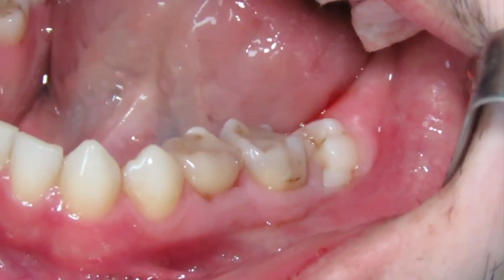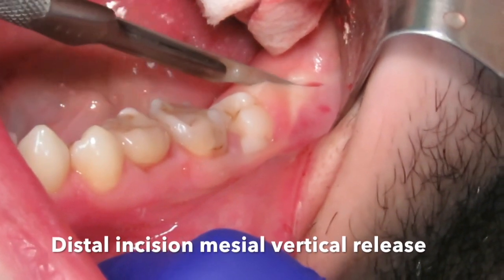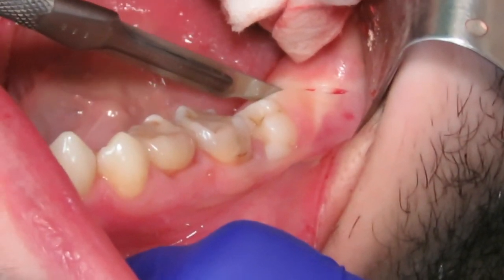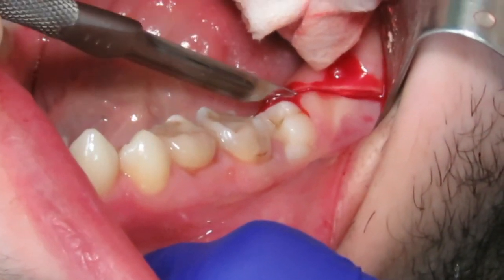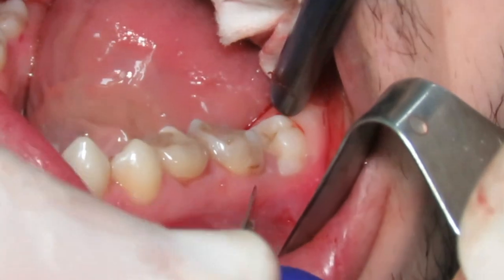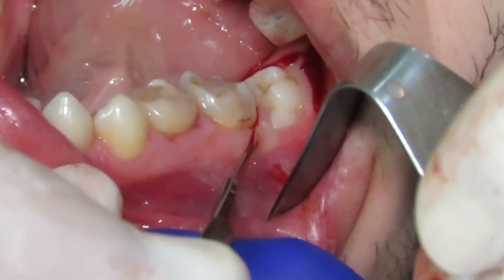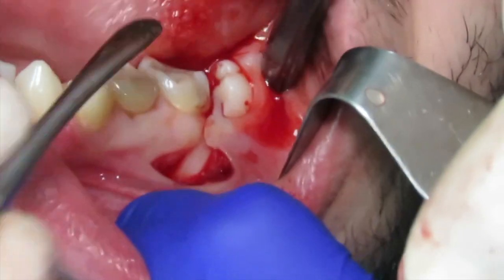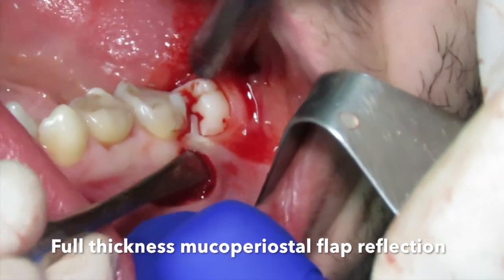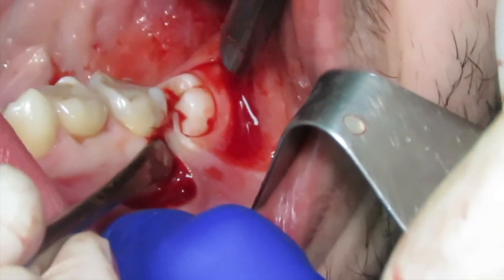In that case, we started here the surgery, did an incision, a distal incision, and a relaxing incision on the mesial side, anterior side, mesially. Full thickness flap was elevated at this stage.